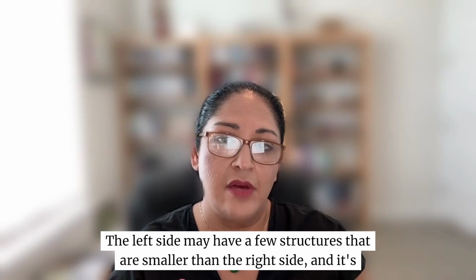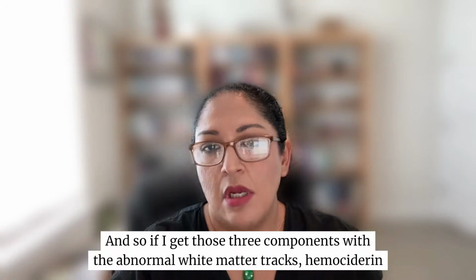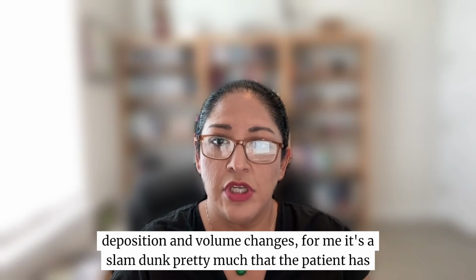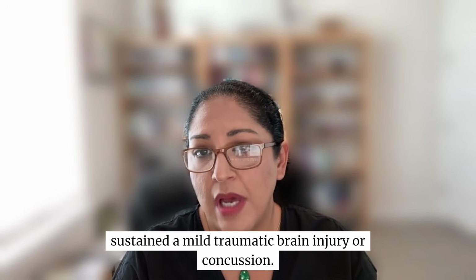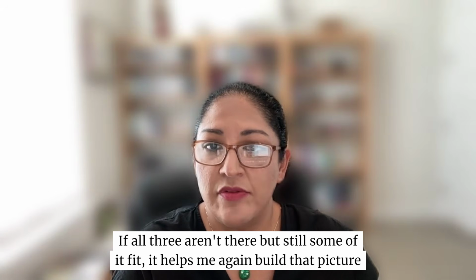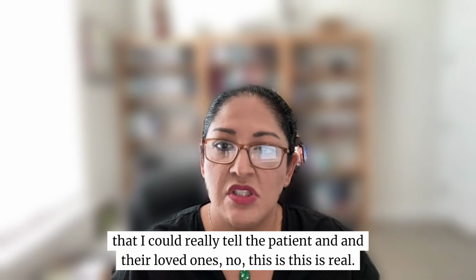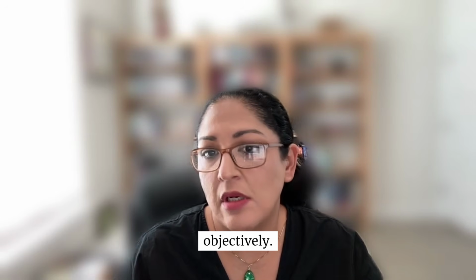The left side may have a few structures that are smaller than the right side, and it's out of the normal range. And so if I get those three components with the abnormal white matter tracts, hemosiderin deposition, and volume changes, for me, it's a slam dunk pretty much that the patient has sustained a mild traumatic brain injury or concussion. If all three aren't there, but still some of it fits, it helps me, again, build that picture that I could really tell the patient and their loved ones, no, this is real. This is something that the patient is experiencing, and we can document it objectively.